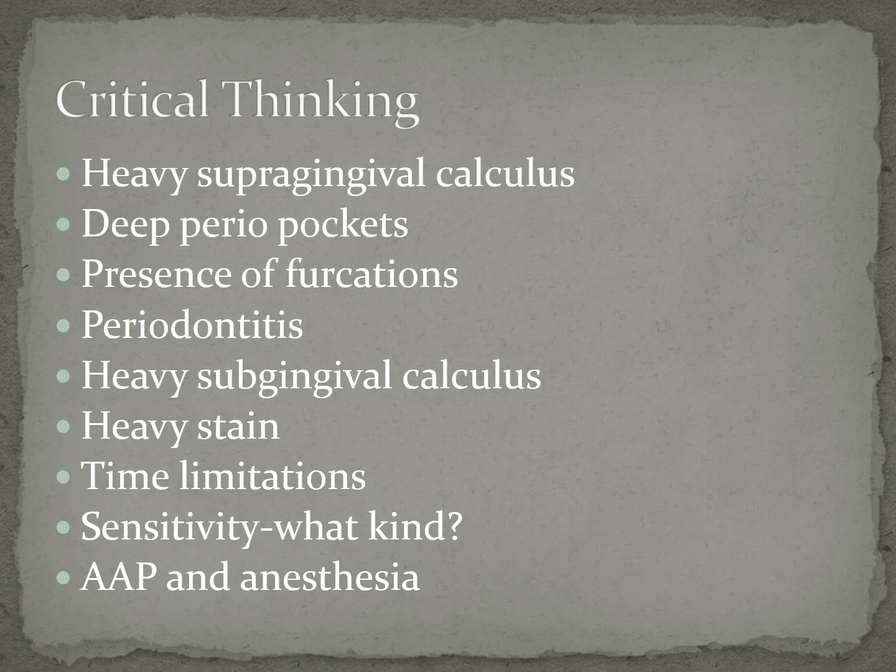If there's a furcation, I may need to find a furcation tip and I may need to get inside there. If my patient has periodontitis, if they have heavy subgingival calculus, I'm probably going to want to use a universal or a thicker tip so I can get it down in there a little bit deeper. If they have heavy stain, okay, it's going to save my hand if I can go over that heavy stain with an ultrasonic scaler. Okay.